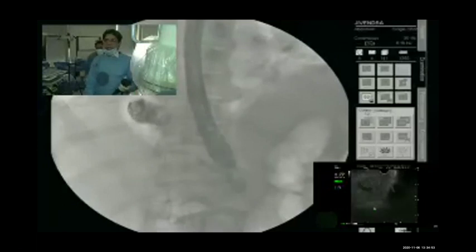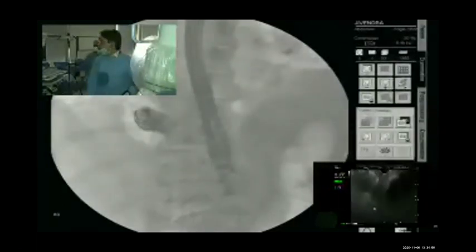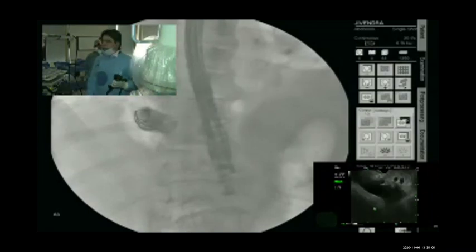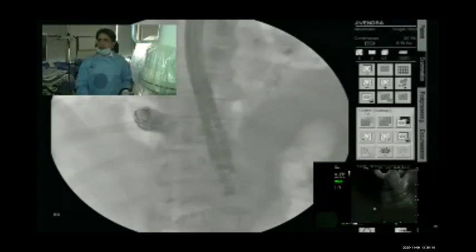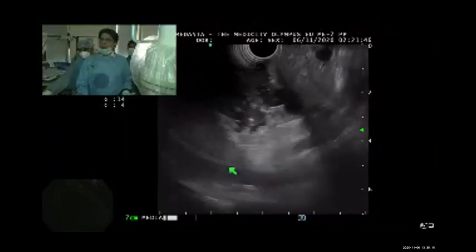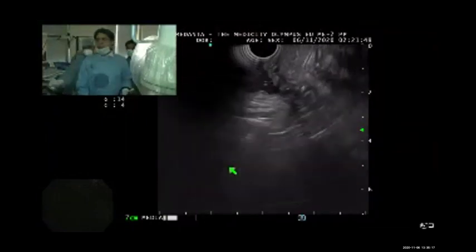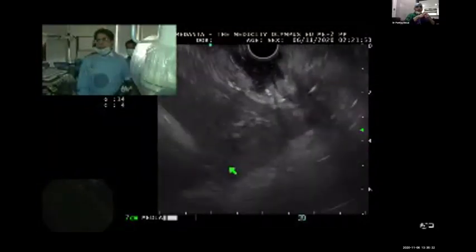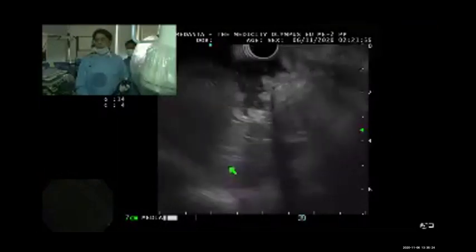And endoscopically, we have observed for more than 10 to 15 minutes. There is no blood. We can see absolutely clean water. The water coming out with the suction in the EUS image also shows clear water. Can we make the endoscopic image bigger? Now you see there is no blood; this is the retained blood which was there, there is no fresh blood. Okay, thank you, that's wonderful, Rajesh.